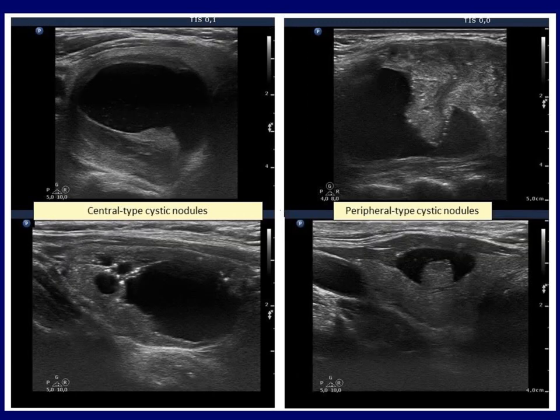The final distinction relies on the appearance of the solid proportion within a mixed predominantly cystic nodule. If the solid part can be followed all along the inner surface of the nodule, then the nodule should be classified as a central type lesion. We meet this subtype in follicular adenomas. Peripheral subtype means that the solid part bulges or projects into the cystic cavity. The peripheral type is typical both of benign hyperplastic nodules and of papillary cancers.